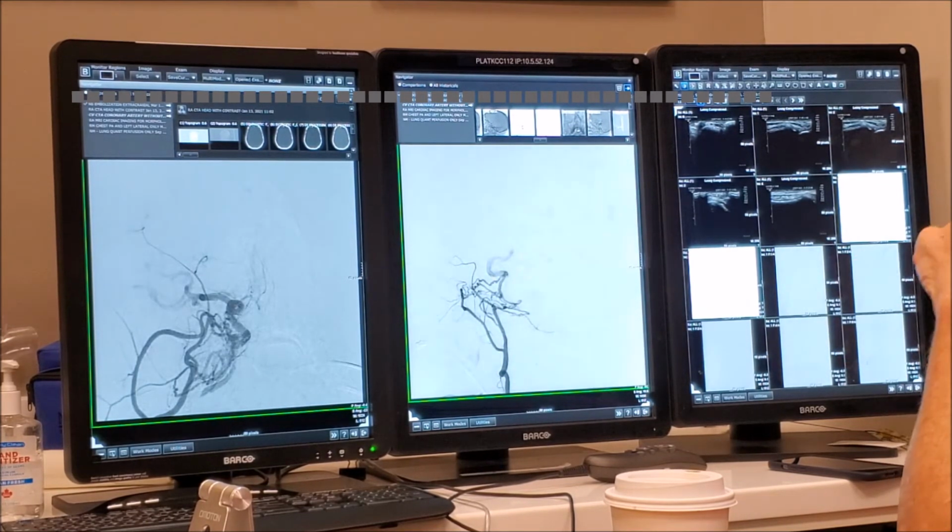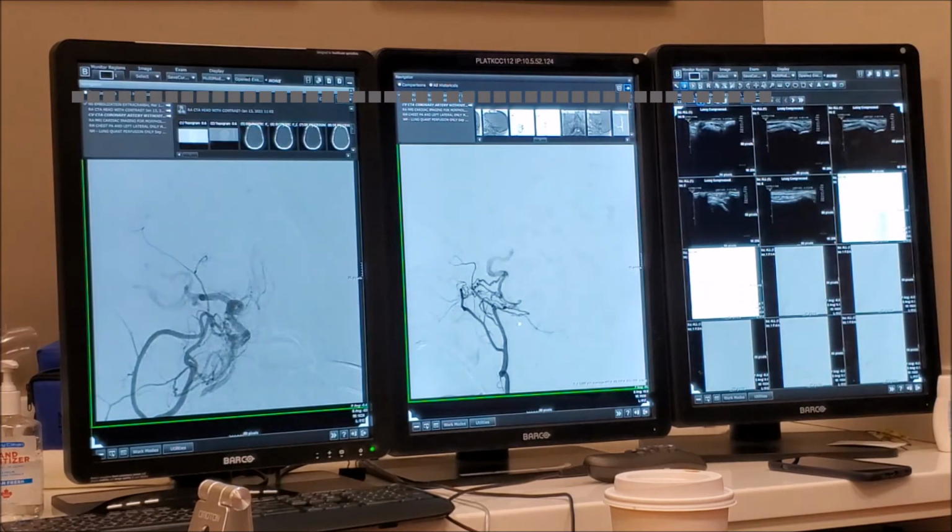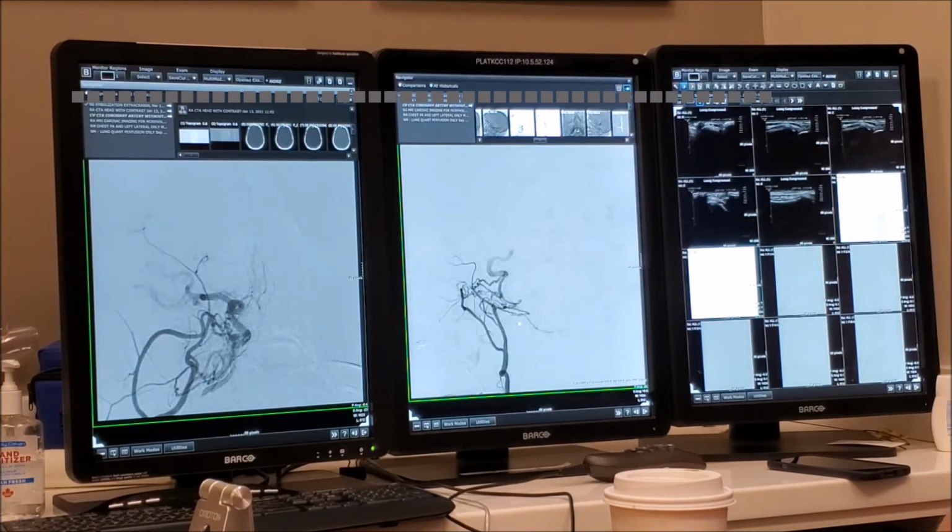So you repeated this. Okay, this is much better quality. This is definitely something. I'm almost sure this is the stapedial artery. See if the book of anatomy has it. I have the anatomy book. Greg, look on the bookshelf there, you can close my luggage there. See if there's volume 1 of anatomy. Okay, so look for the stapedial artery. Let's see if we can find something similar.